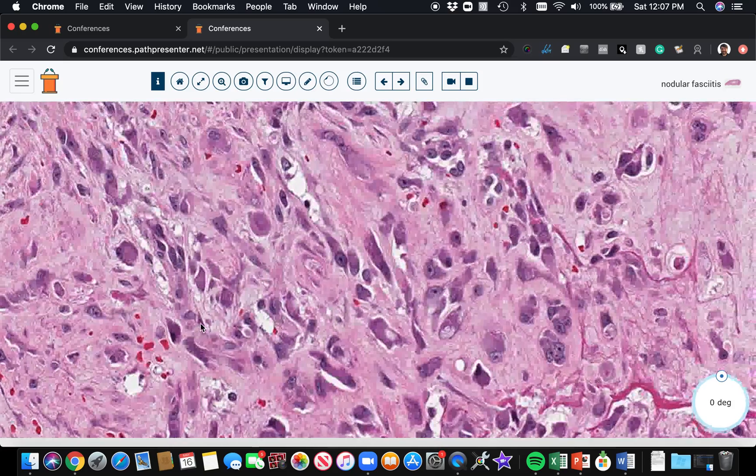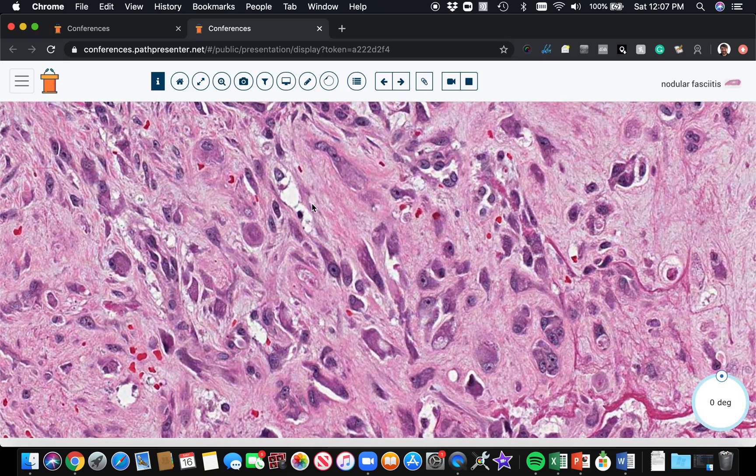But it's really important and it's an easy mistake to make if you don't recognize this lesion. So burn that into your mind — this is proliferative fasciitis.